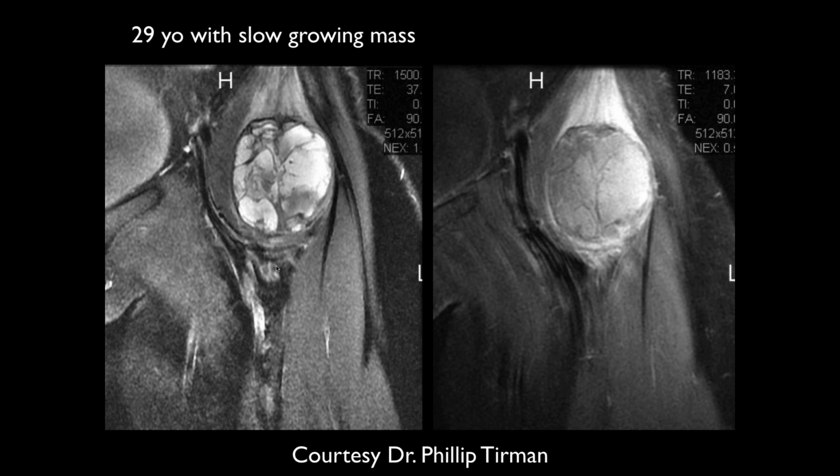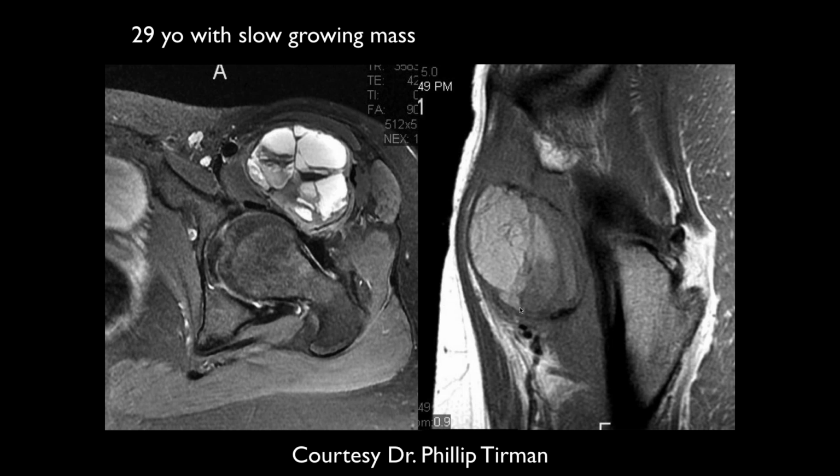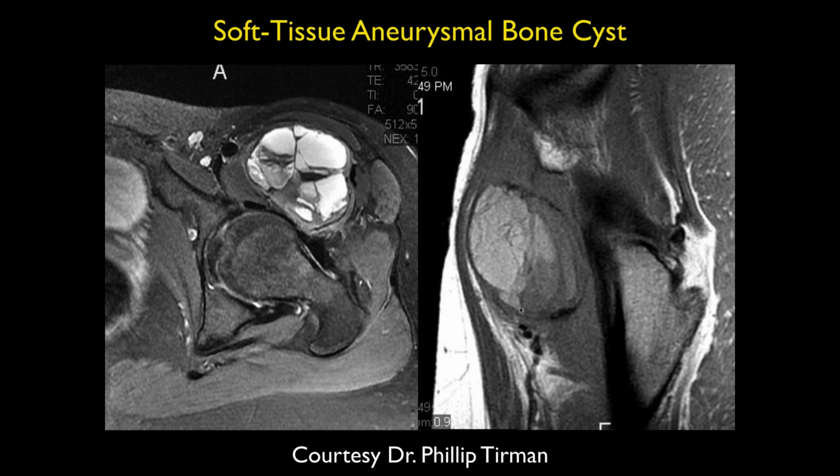Okay, so within the soft tissue, we have a very well-defined, rounded, multilobulated lesion with many septa and heterogeneous signal within it. This is probably PD fat sat, and this is probably T1 fat sat post. On the axial images, I don't see any fluid levels within the lesion. It's entirely within that muscular compartment. It's not infiltrating elsewhere. Our patient is young, but I still would be concerned for malignancy in this case. Oh, okay, that was wrong.